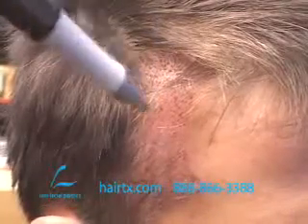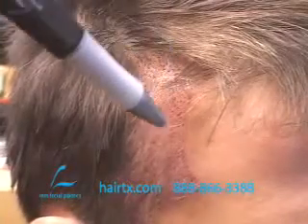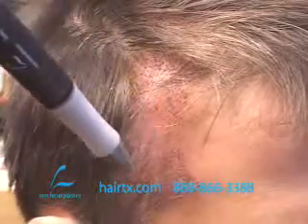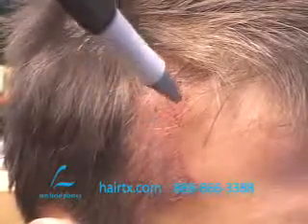I was talking to a gentleman who we're going to transplant this coming Monday, who has a very unnatural hairline — a huge component of which wasn't balanced to his temple, done somewhere else. The goal here — and again, this gentleman didn't have a transplant — was to give better blending and shape to his hairline. The other outfit said they weren't going to do a transplant for his temple, and I'm glad, because temples are the most difficult thing to create other than the crown. These angles using the coronal technique are completely flat, and they blend to the angle of his existing hair. There's a slight sweep forward, down, and back. I looked at what I call ghost hairs — the remnant ghost hairs of his former temple — and I followed that pattern.